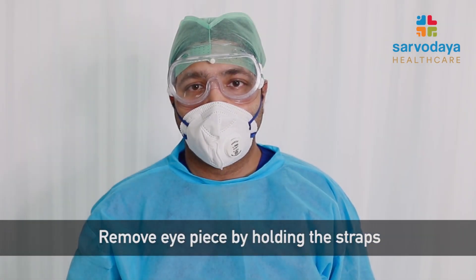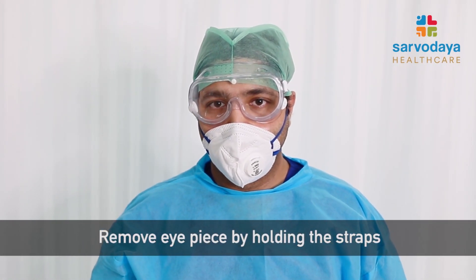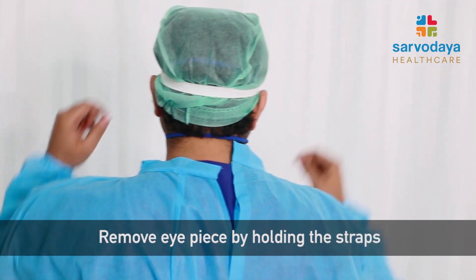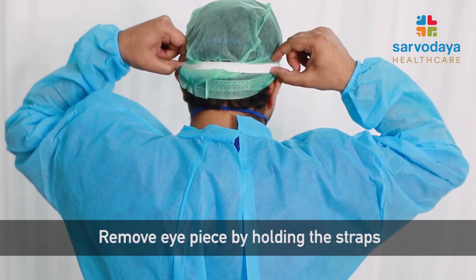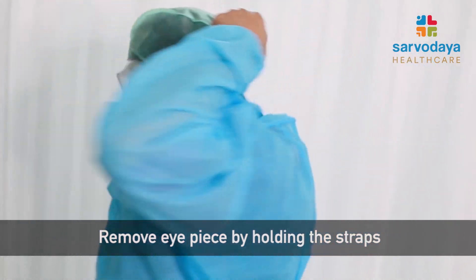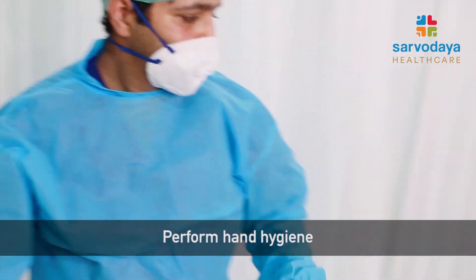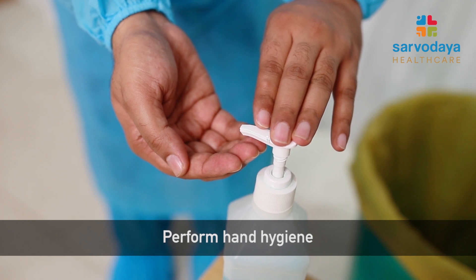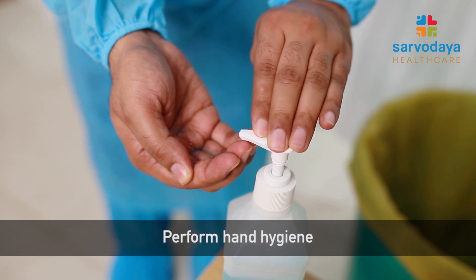Similarly, to remove the goggles, we need to touch only the strap of the goggles as demonstrated, then pull it out and discard it in the bin. After removing the face shield and the gloves, it is advisable to do hand hygiene as demonstrated.